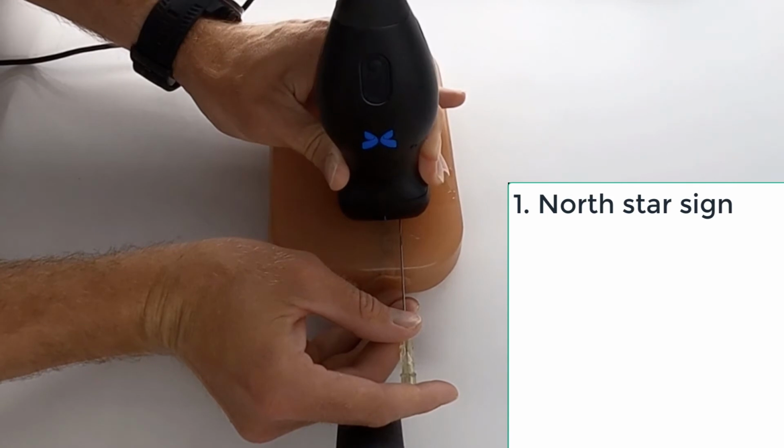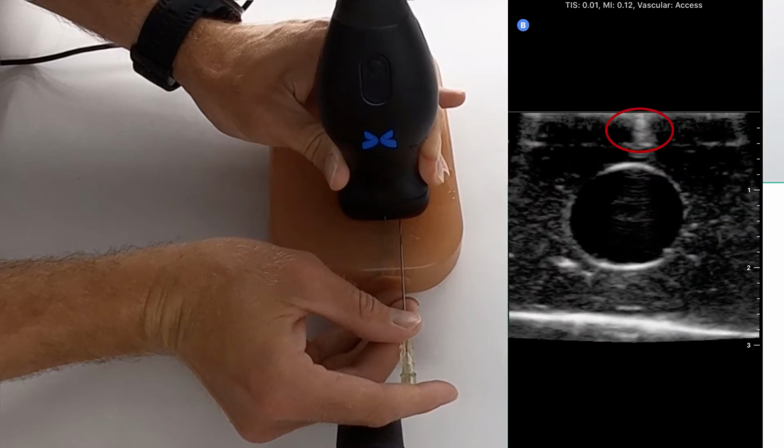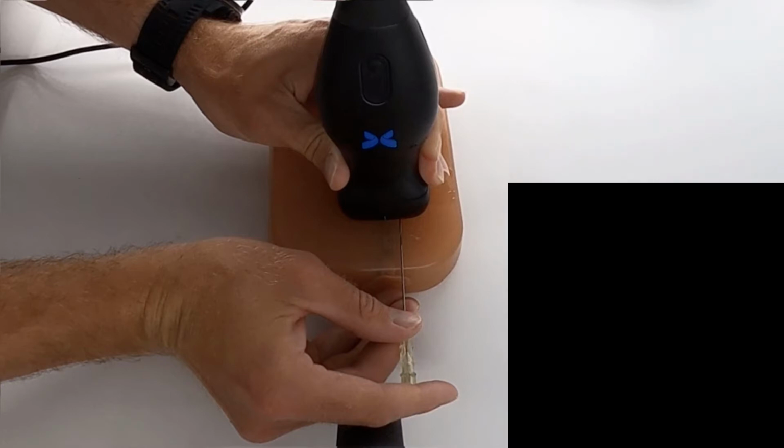And what you're going to see, if you look at the images that we've got, is a hyperechoic dot on the very near surface, the near field of the ultrasound image. You're going to see a hyperechoic dot from the needle, and then you're going to see a ring down artifact coming down from the needle tip through the deeper portions of your image. What that allows you to do is center your needle before you poke the patient. And with these small veins especially, it is critical. If you're off a couple of millimeters, you may not be able to get the angle you need to get to that vein successfully. So before you even poke, get that needle centered. How do you center the needle over the vein? By getting the North Star sign.